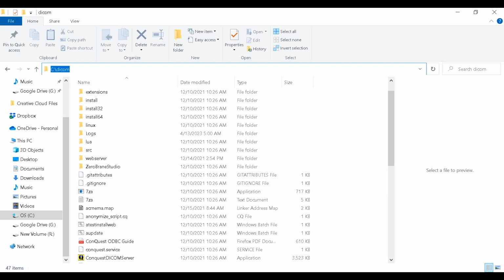Here's why. This program was old school Linux, and pretty much just about an evolved version of Unix. I'm surprised it has a GUI. Okay, and in fact, it doesn't have to have it. By the way, for those of you that know what the term GUI means, you can click on a mouse, right?